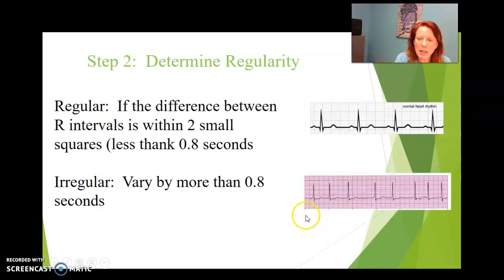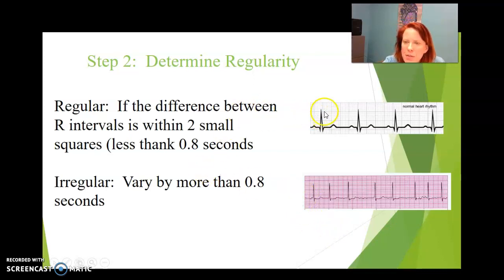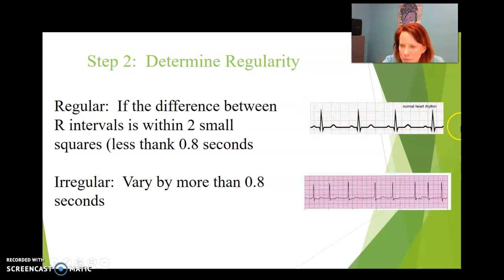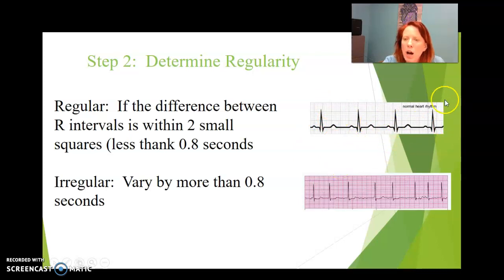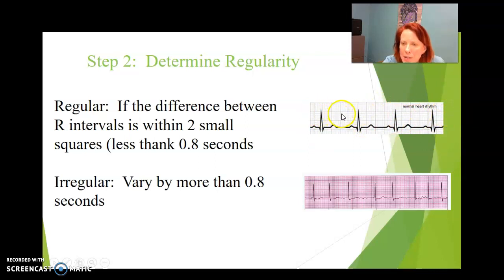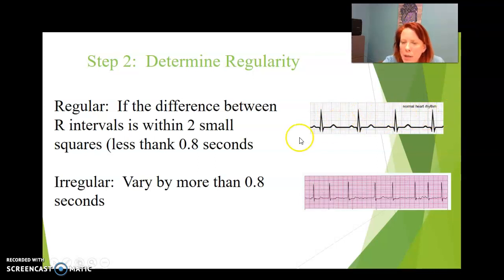Determining the regularity: when you look at this strip, this has 40 beats per minute and it is regular. Regularity means the beat comes in a regular pattern — when you look at it with your eyes, you can see the beat is at a regular value. You can tell by counting the squares between the big squares between the R peaks.